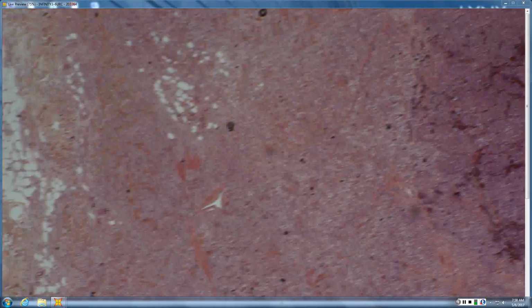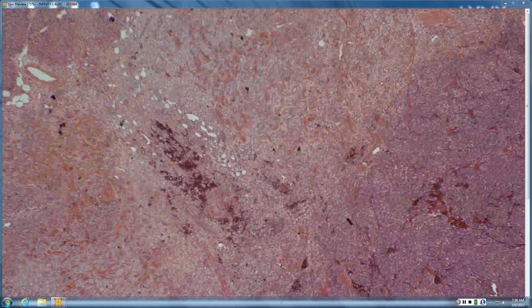Probably neither is wart, but certainly some people like Dr. Ackerman said they're warts, right? There's no evidence that that's true. In terms of papillomavirus, there are certainly some warts that can look similar, which is really what he was saying. Some follicular warts can look similar, but in a true case, like a patient with Cowden's, there's no papillomavirus.